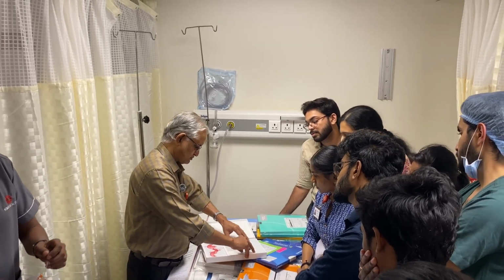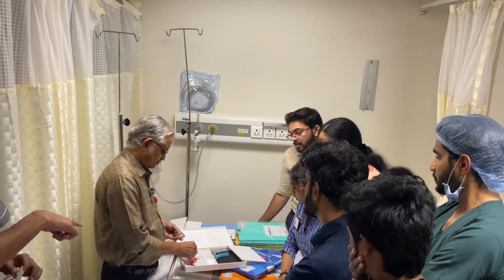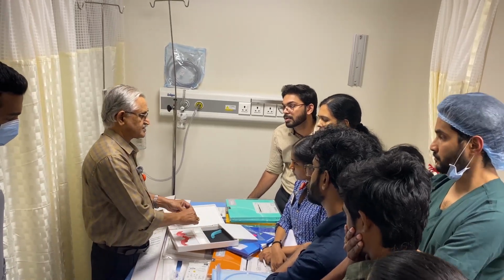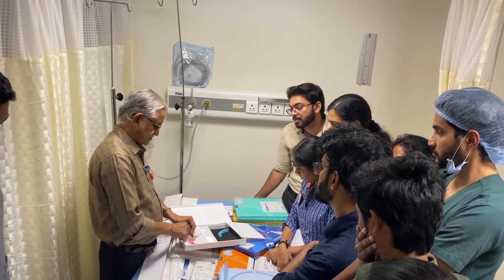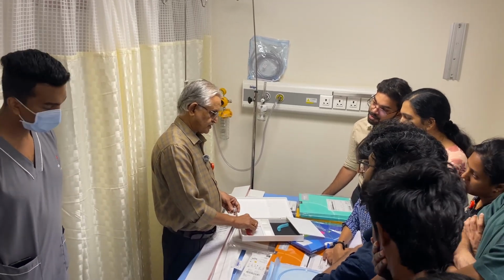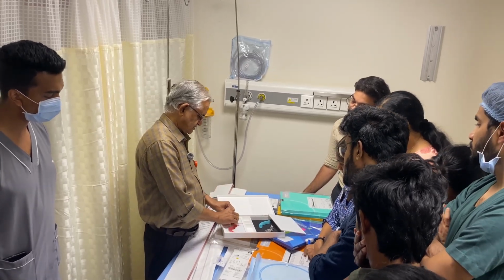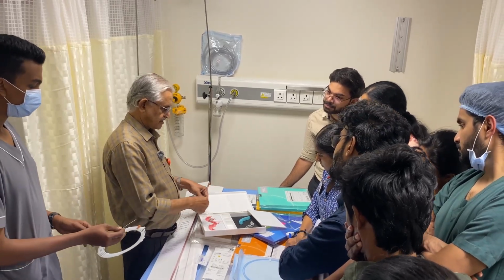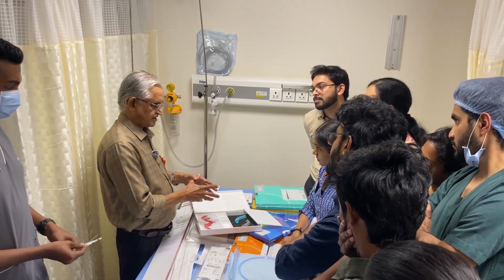Another way is, suppose it is a little wide aneurysm, but still you can use coils, with stent assisted or balloon assisted coiling. You can keep a stent there, and through the stent struts you keep the microcatheter inside, so it will protect the neck, and then you can deploy the coils there. But finally, in coiling, you have to completely pack the aneurysm with coils. Any amount of blood going in will keep the aneurysm growing unless you pack it nicely with the coil.